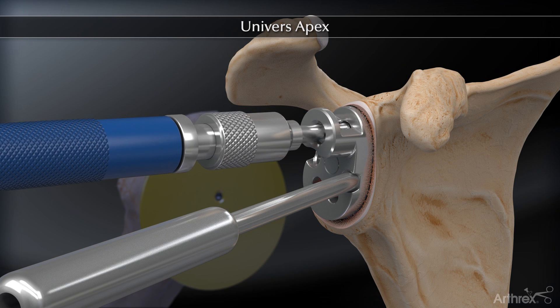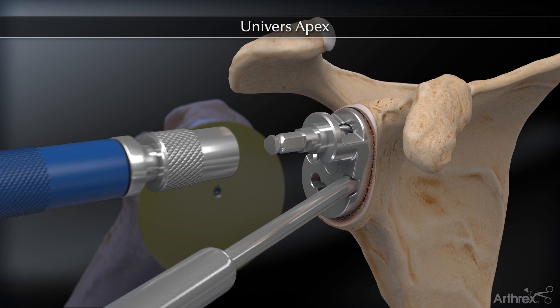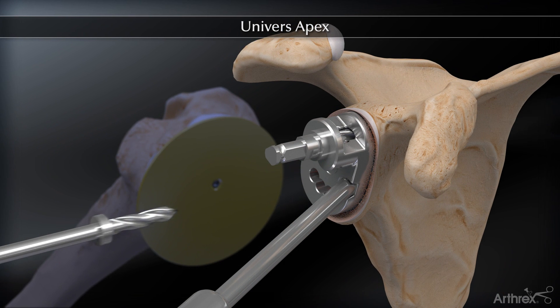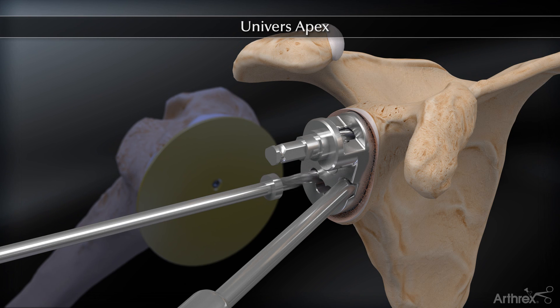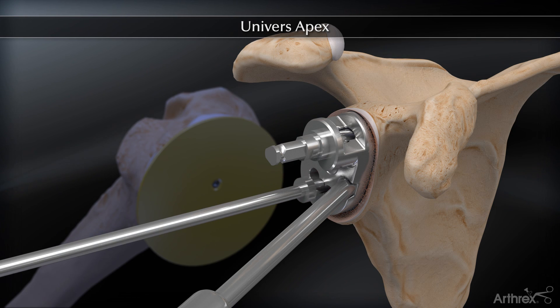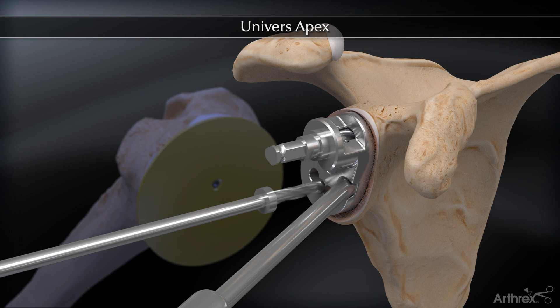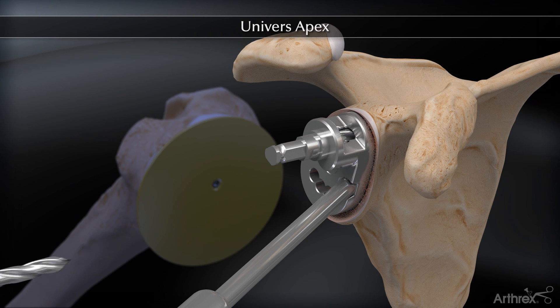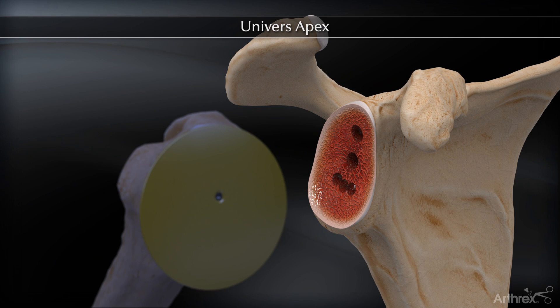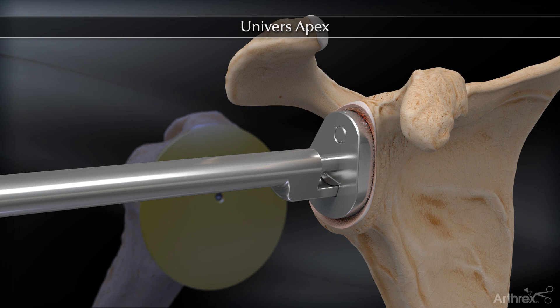A short removable drill bit is used to drill the superior peg hole. It is left in place to stabilize the guide for inferior drilling. The inferior drill bit is then used to prepare the inferior horizontal peg. The pegged glenoid punch finalizes inferior horizontal peg preparation.